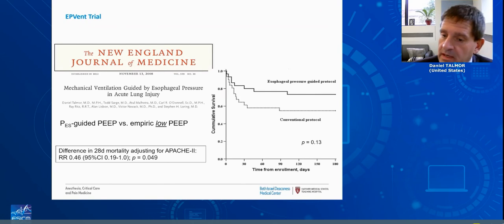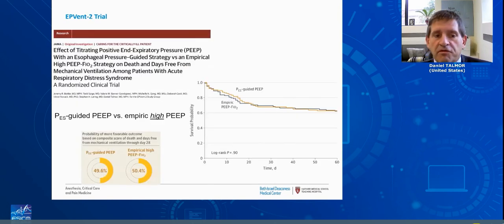And we demonstrated that in this small study that was published, really a preliminary study that was published a few years ago, where using a strategy to keep transpulmonary pressure above zero was associated with improved patient outcome in a very small study. Now, the study I would view this more as we didn't hurt people. I wouldn't necessarily say that it helped people, but that protocol of keeping transpulmonary pressure above zero seemed not to harm patients.